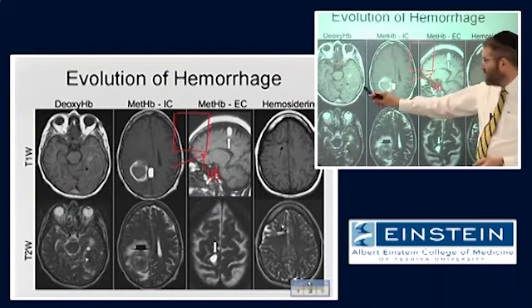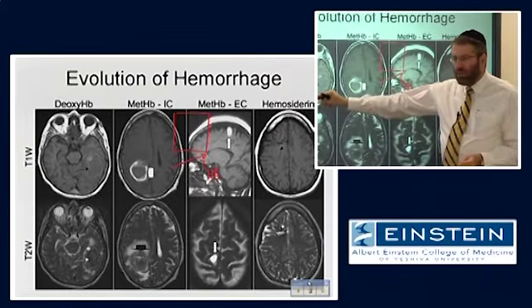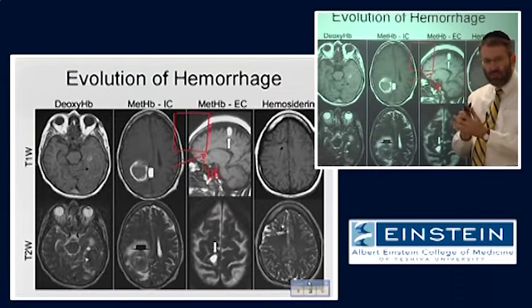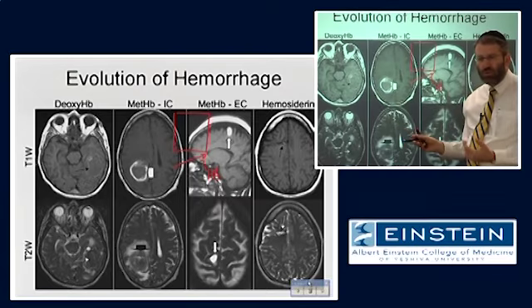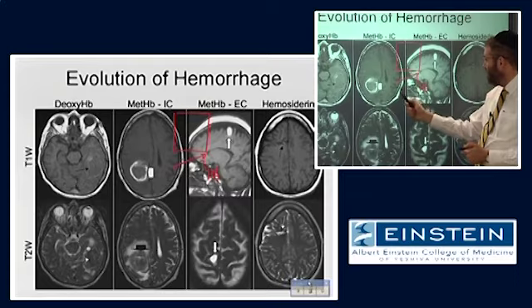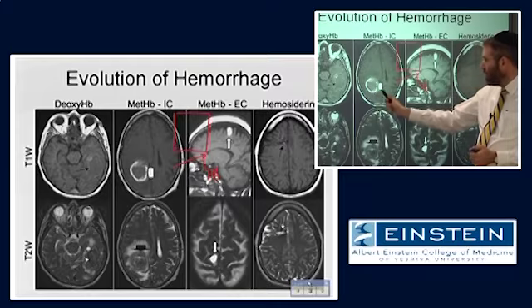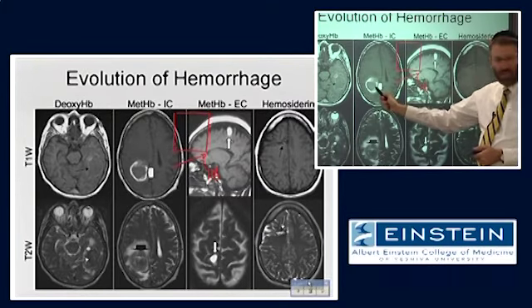So deoxygenated hemoglobin, notice that it has no effect on the T1 weighted image because the molecule shields those water protons from getting close enough to the iron electrons to undergo that proton-electron dipole interaction. As soon as we have methemoglobin, right, that's no longer the case. In this example, the periphery is methemoglobin, the center is still deoxygenated hemoglobin.